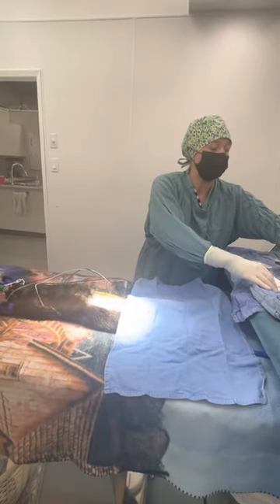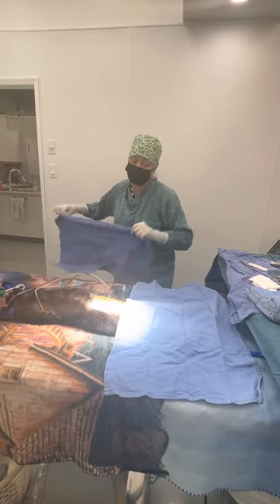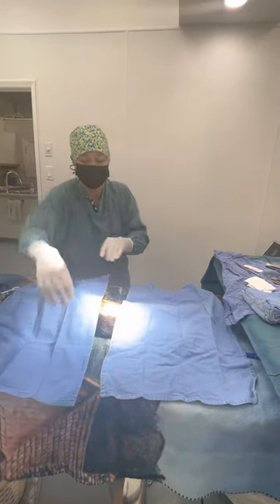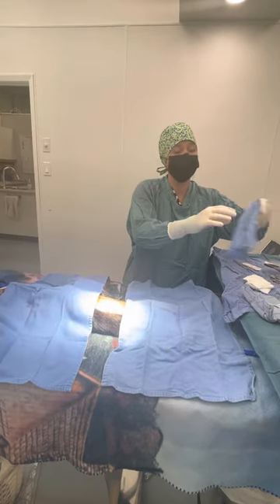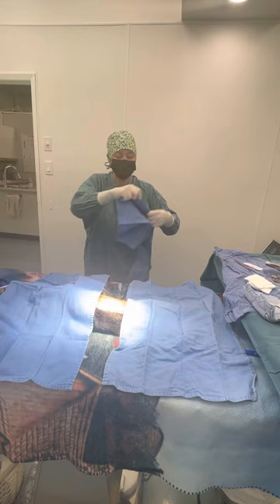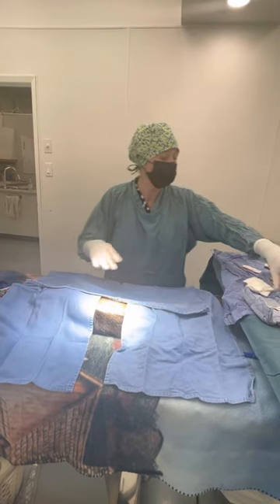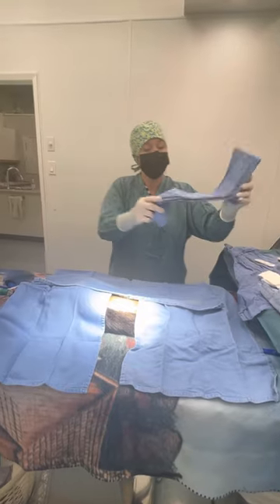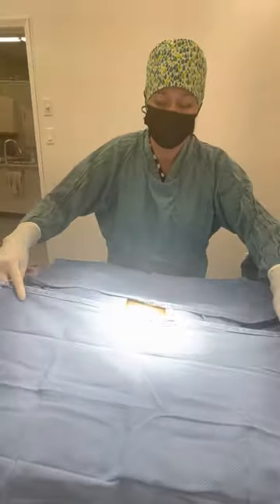However, it is spring right now and even young cats will come into heat easily at a young age. So the first thing I'm doing is starting to drape her to make a surgical field so that it's nice and sterile. When I enter her abdomen I don't want any bacteria or germs of any kind getting inside of her, so I make it as surgically sterile as possible.